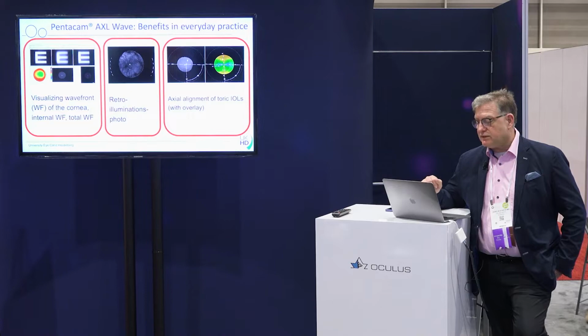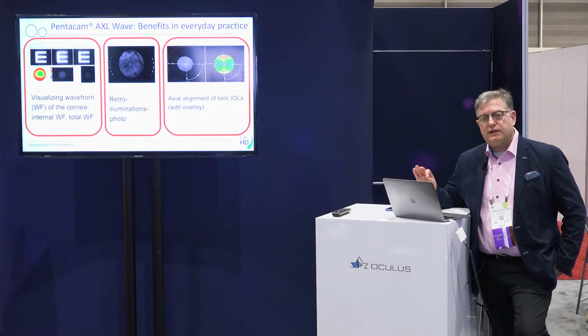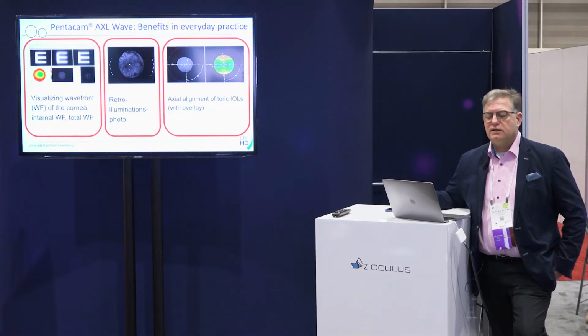Another thing which I like, and I will show you some cases, is that you can very nicely measure the axial alignment of a toric lens, due to the retroillumination photo. You can also do an overlay with the tomography, and then you see if your toric lens is really fixing the problem or not. So let's look at some cases.